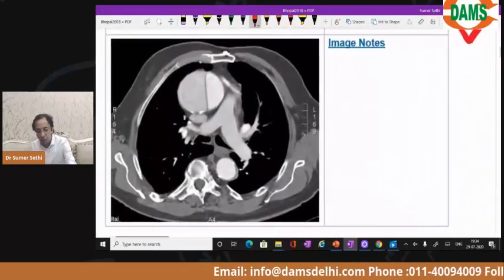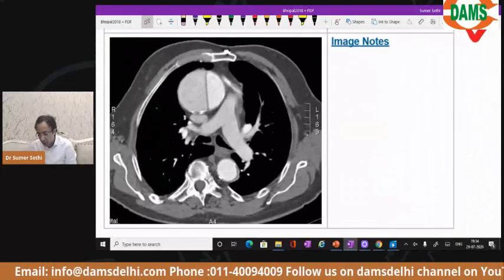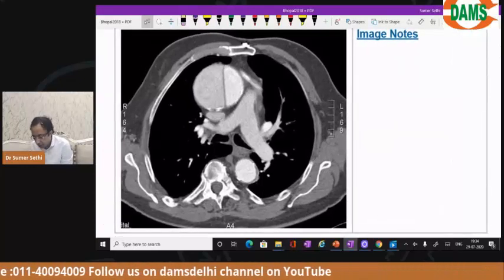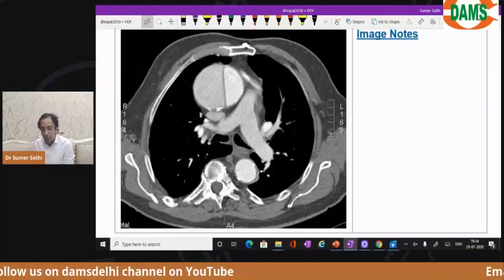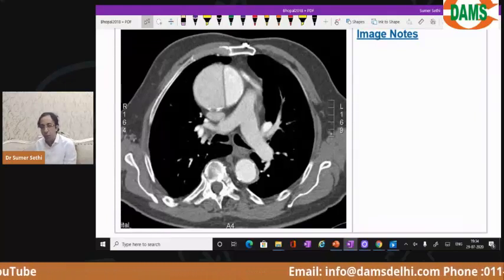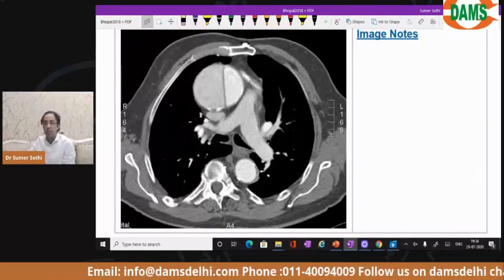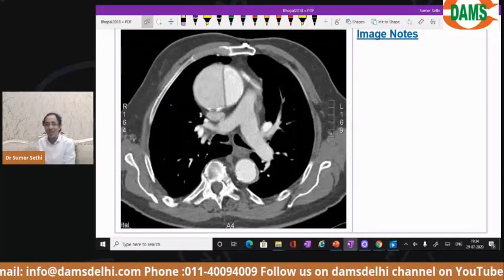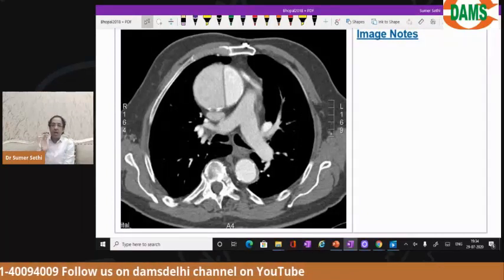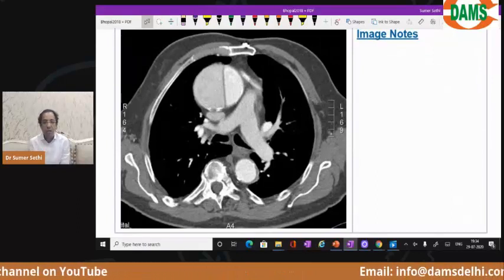Okay, let me ask you a visual again. So that embolism was at the bifurcation. Correct, beta, correct. No, beta, some students are getting confused. When I said femoral artery earlier in the brain, I said it in DSA. I said femoral artery in digital subtraction angiogram, not in CT angio. CT angio will always be with IV dye. Okay, CT angio is done after IV injection.